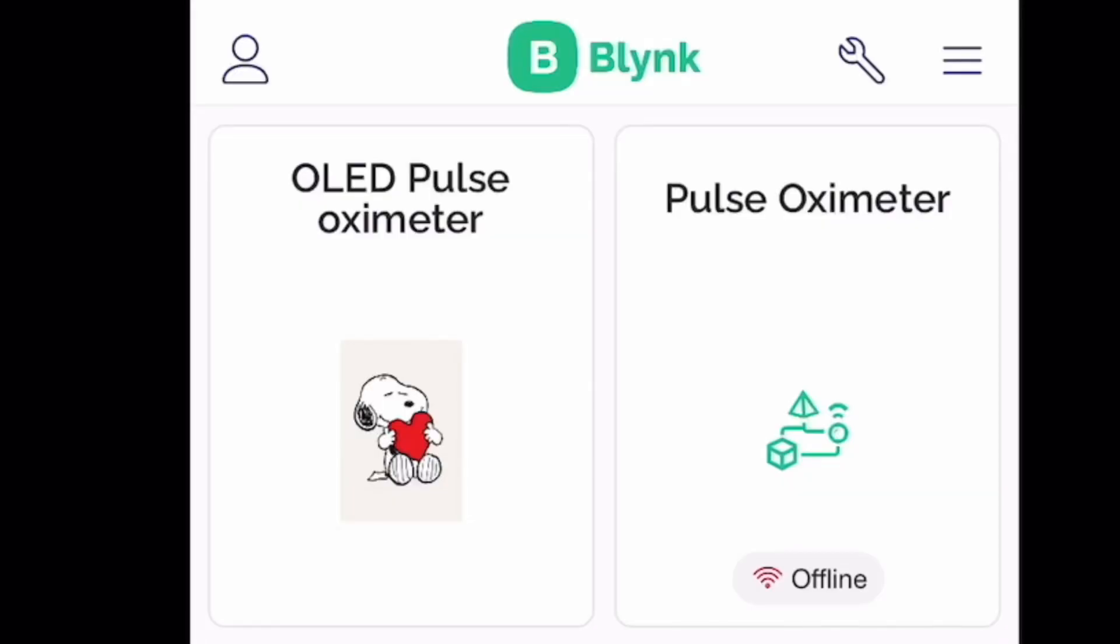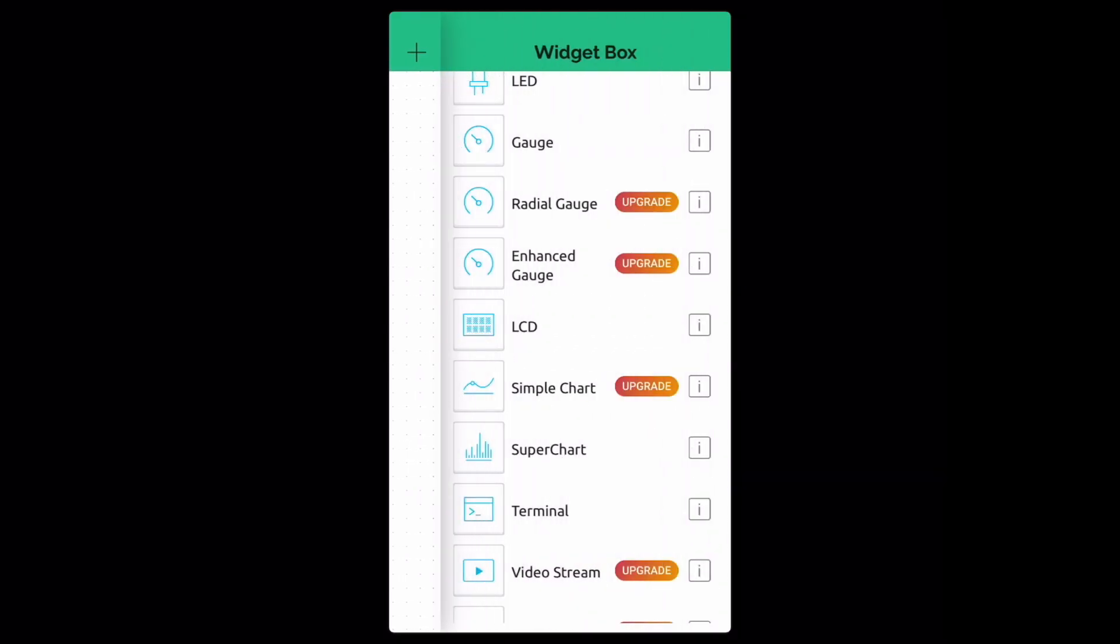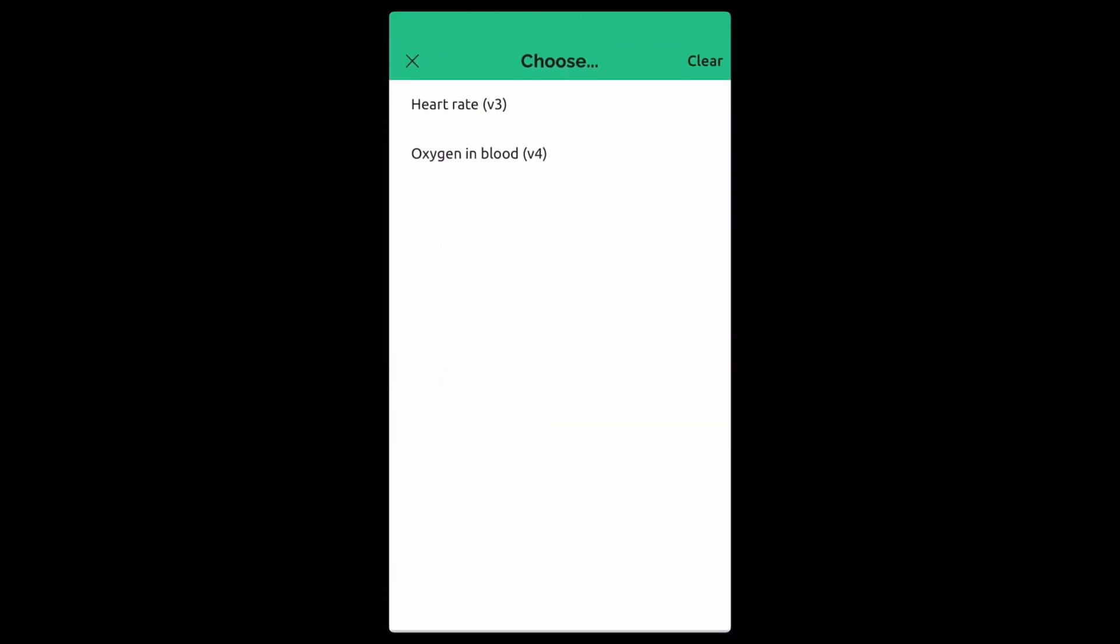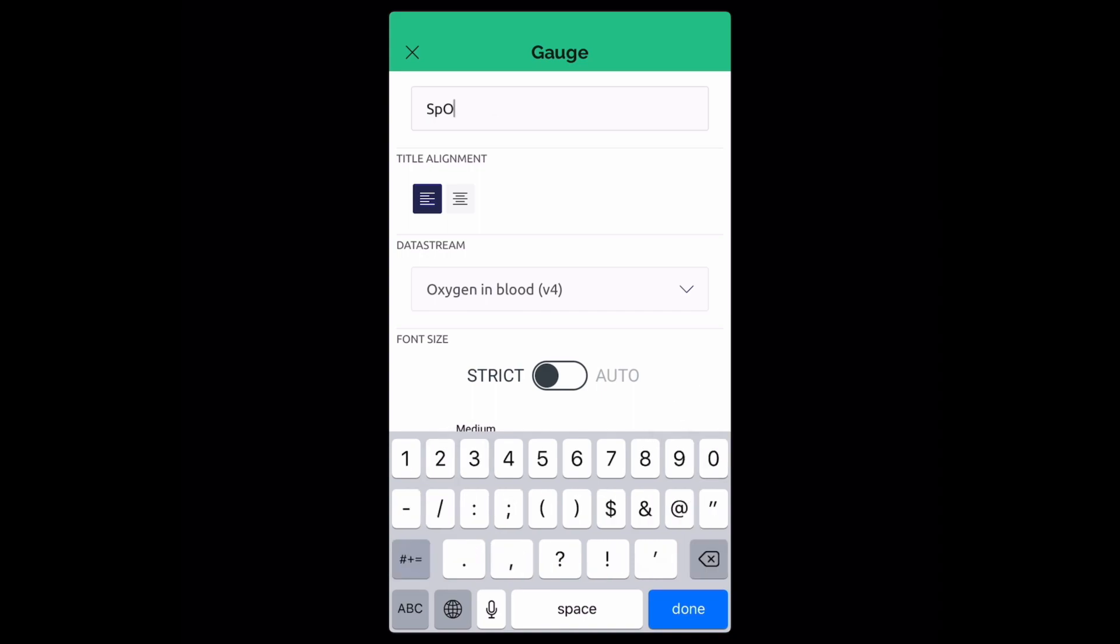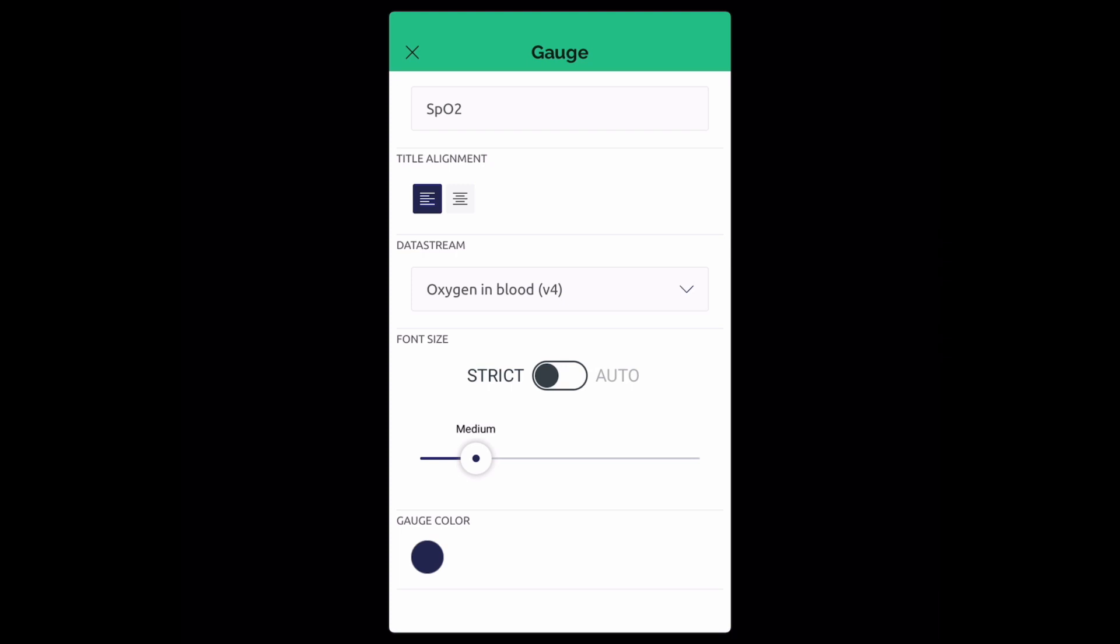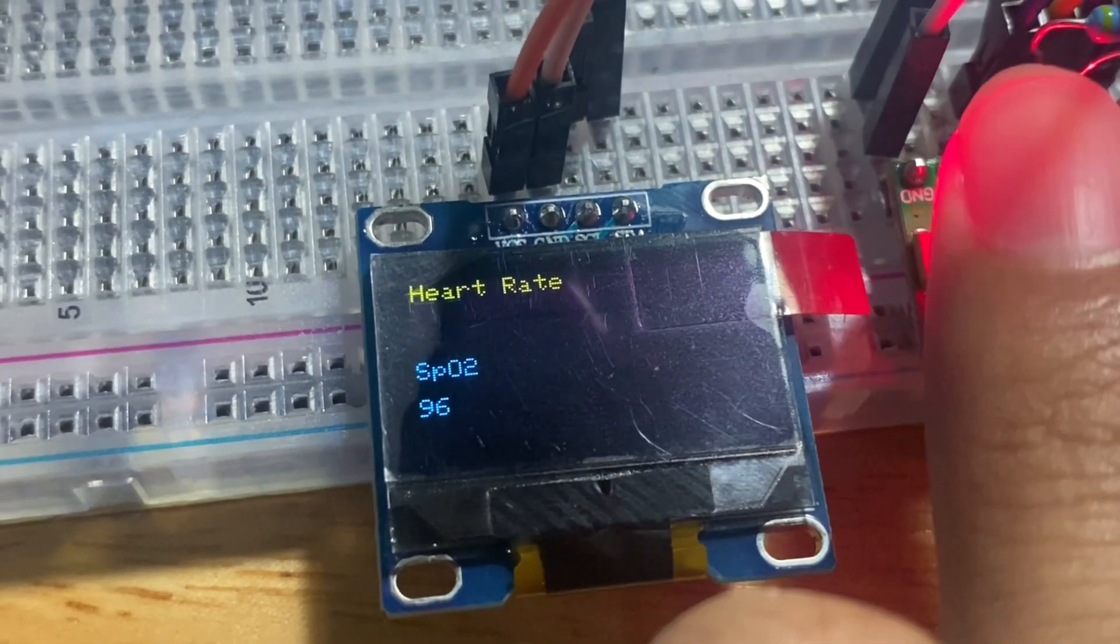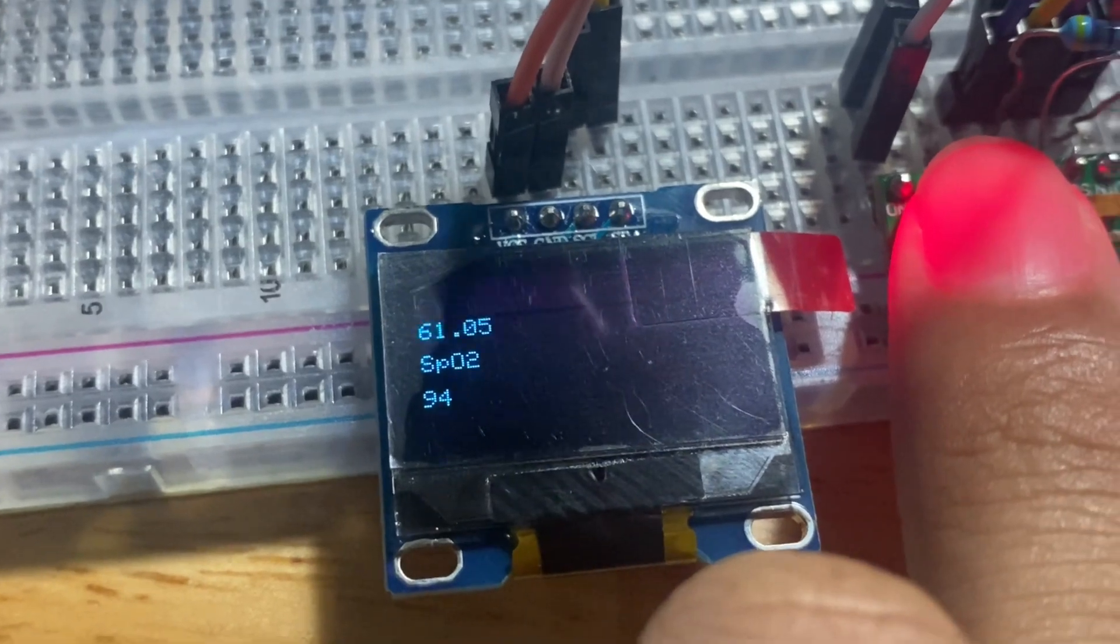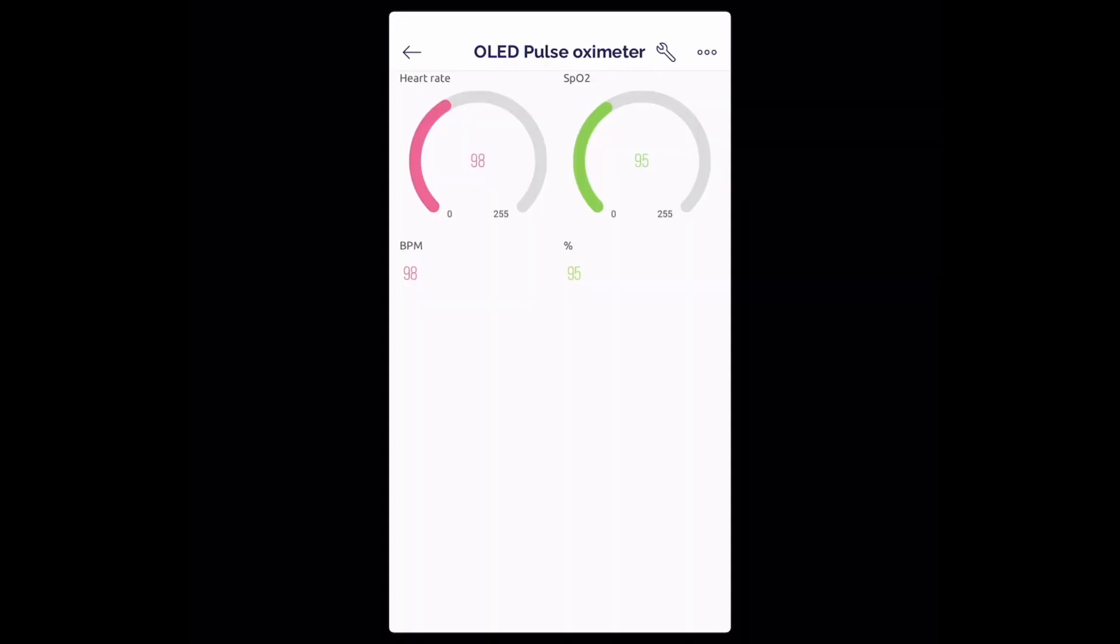To make the data of your heart rate visible on your mobile phone, you can use Blynk application to link it with the Arduino. When you finish setting up, press your finger above the sensor. The data will already be shown in the Blynk app.